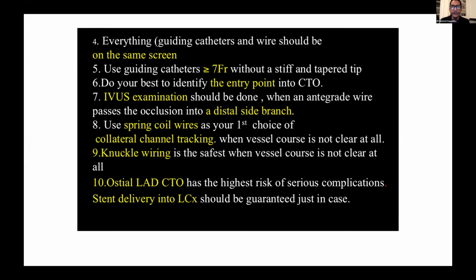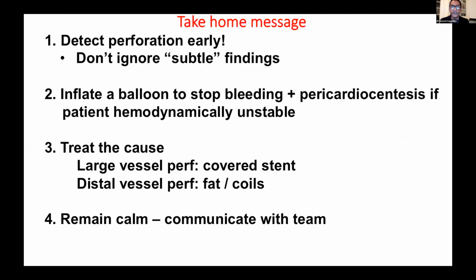And a stent delivery into the left circumflex should be guaranteed, just in case you are going with the LAD CTOs. So take home message: detect perforation early. Don't ignore subtle findings, as I showed you in a couple of cases. Inflate a balloon to stop bleeding, and perform pericardiocentesis if unstable.